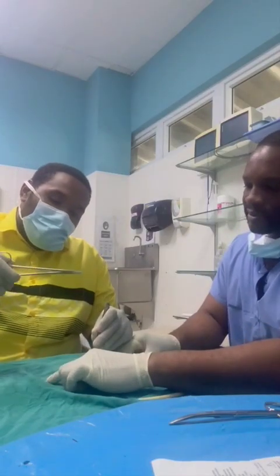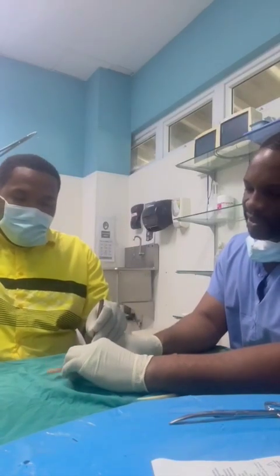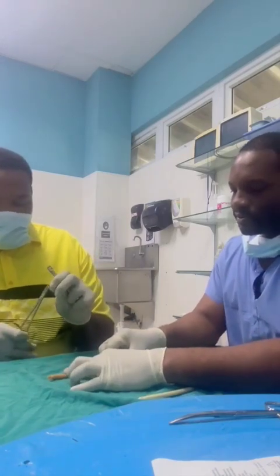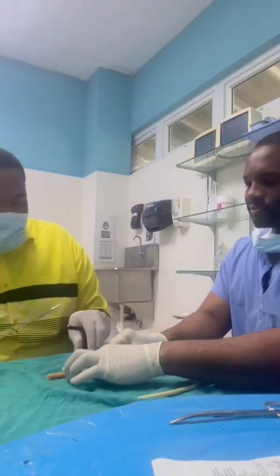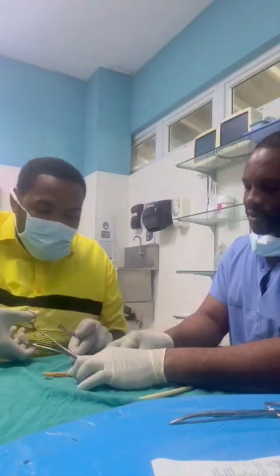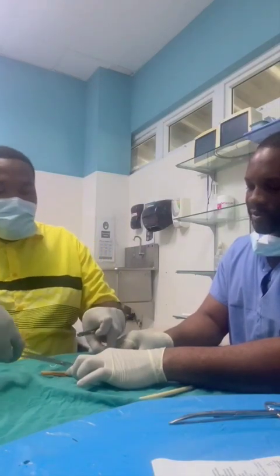Suture and make a knot. That's all right. You're doing very well. I will now make a knot. Would you like to pull this one a little bit? Yes. Very good. I'll first do the surgeon's knot. How many throws? Two throws. Then put the cross.